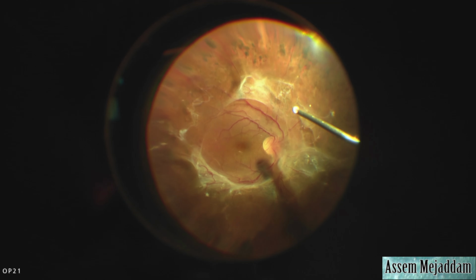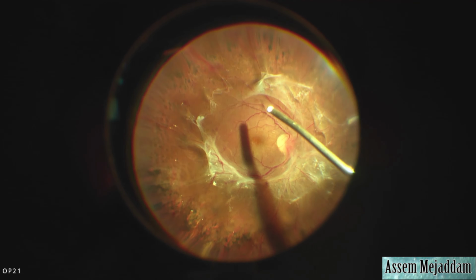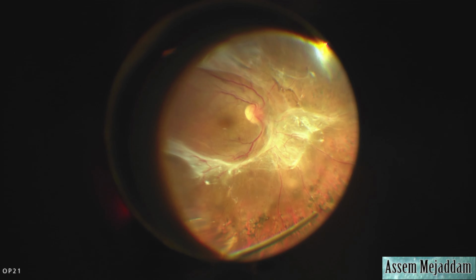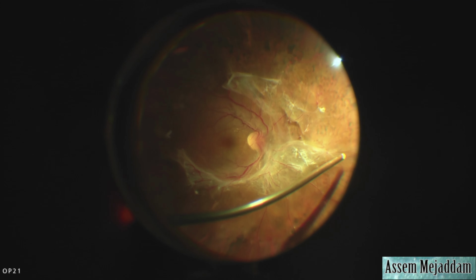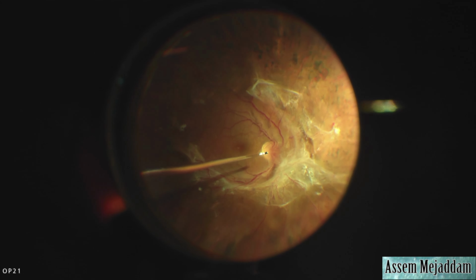This is a case of proliferative diabetic retinopathy, a younger patient who has had a tractional retinal detachment which is gradually closing in on the macula. As you see here, the entire superior quadrants are detached.